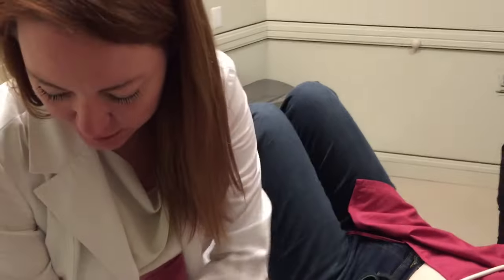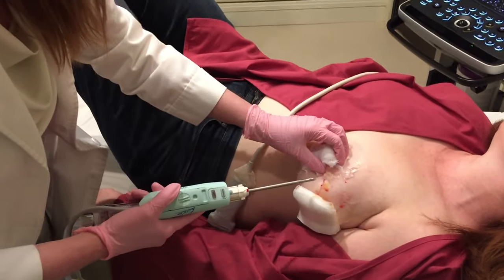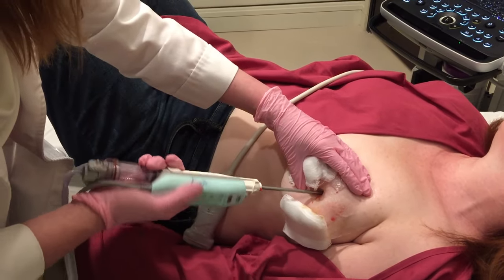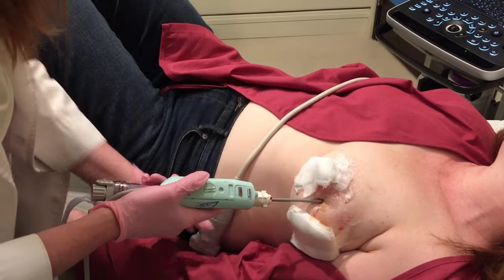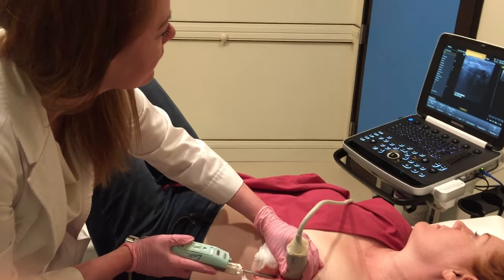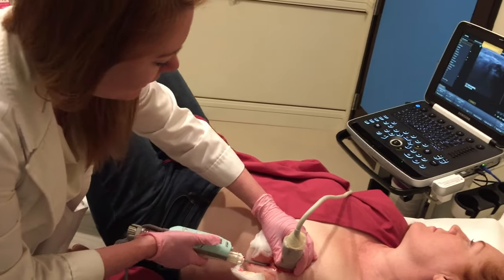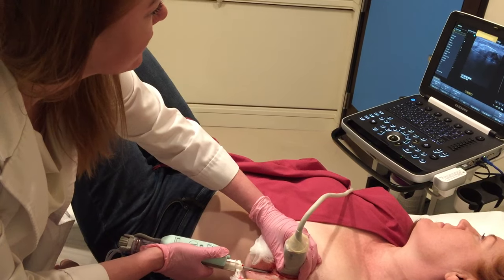We've got this device. We're going to slip it into place underneath the area and press the button about three or four times, and it should remove the area completely. Just a little pressure, a little movement — nothing that hurts. It's super easy. That's right into place really easily, right underneath that little spot. Then we're going to press the button and a little door is going to open, and we're going to see it kind of fall into that little door.